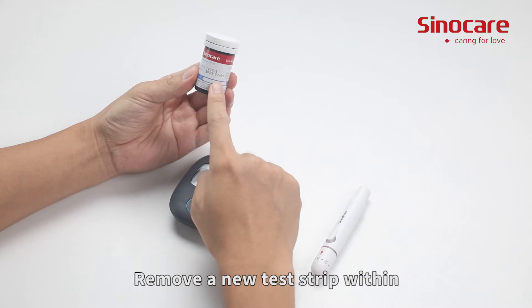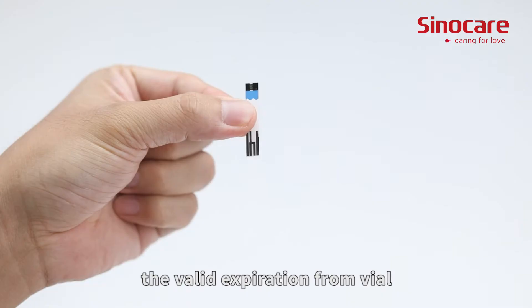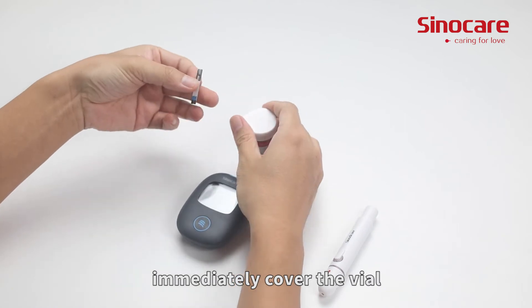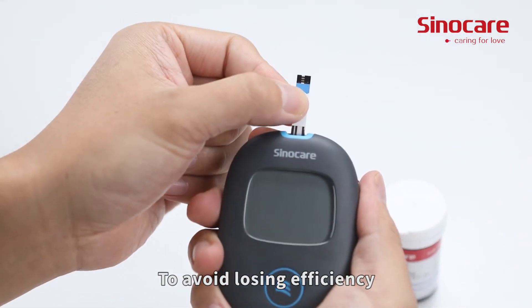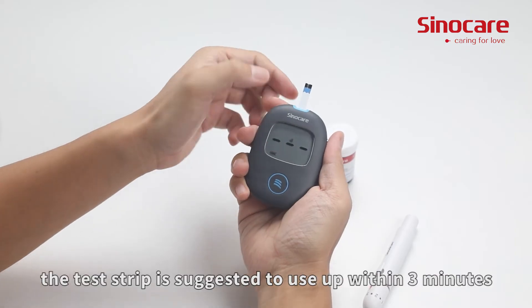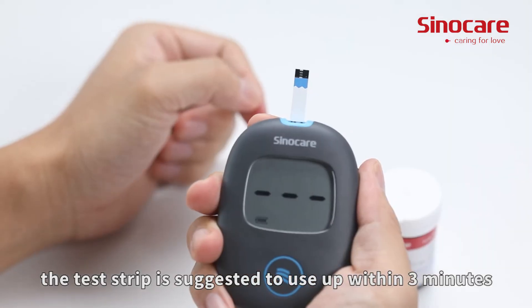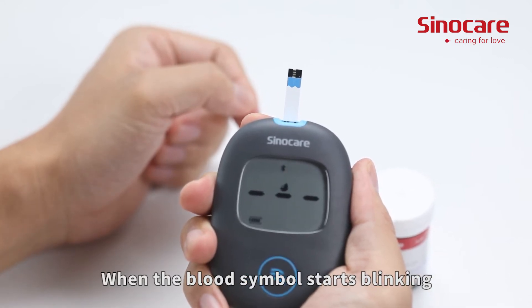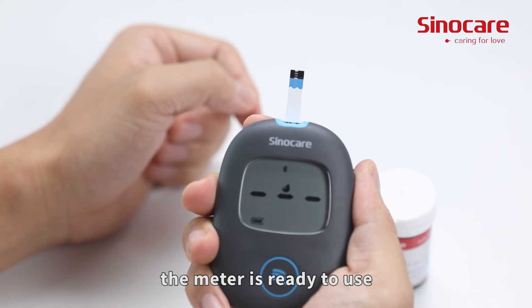Remove a new test strip within the valid expiration date from the vial. After taking the strip, immediately cover the vial to avoid losing efficiency. Insert the test strip into the strip slot. The test strip should be used within 3 minutes. The meter turns on automatically, and when the blood symbol starts blinking, the meter is ready to use.